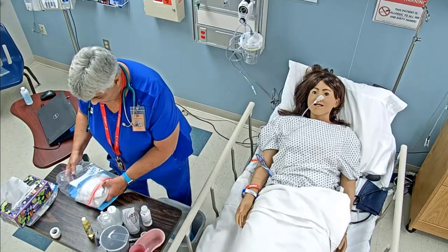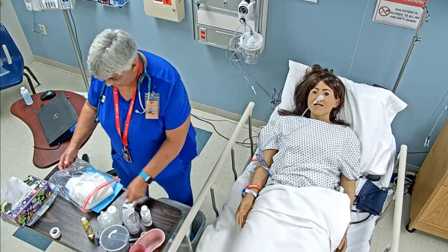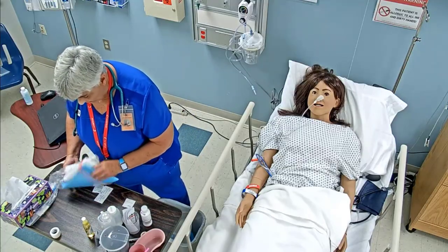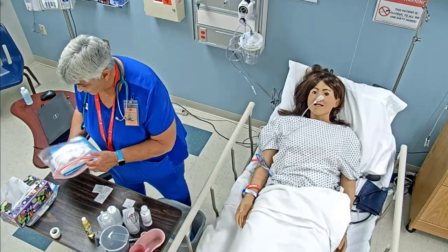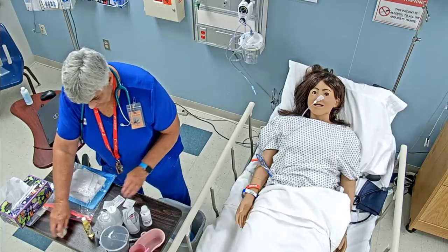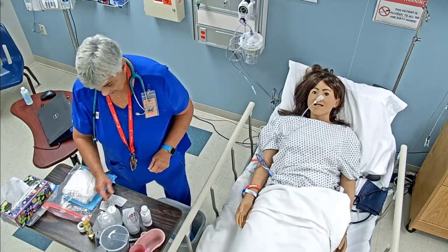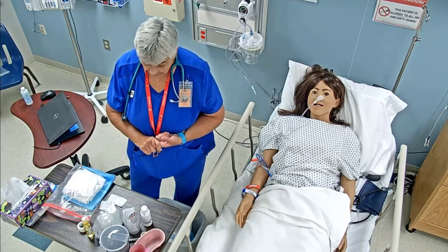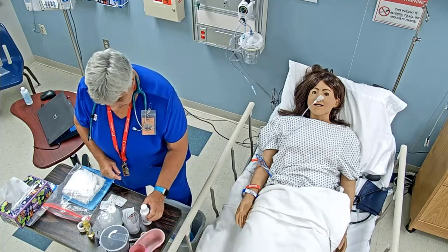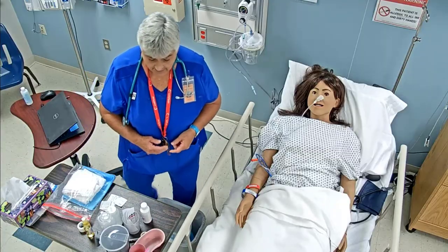So I'm going to go, and a couple of things that we're going to need. We need our adhesive remover. We've got a washcloth and a towel and a blue non-disposable. We've got some tissues. Don't necessarily need tape, but we know that we have our syringe in there. We've got sterile water in there. We've got our pH. We have our solidifier in a basin and a cup.